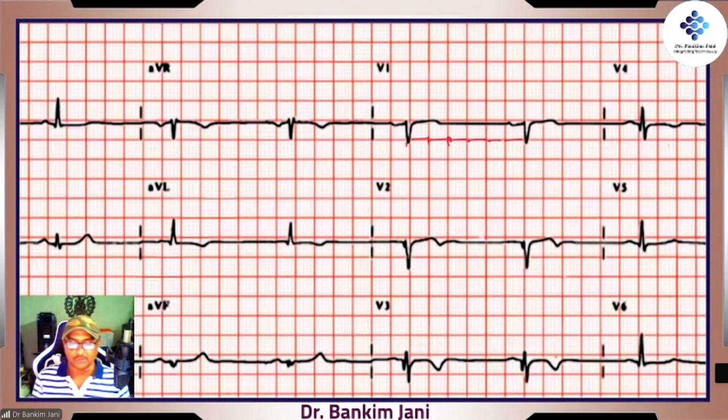Yes. So this is the SA node block. So now the AV node has taken over. Right? When the AV node has taken over, that's why you'll find that the P waves, they are almost, P wave have disappeared. Where is P wave? No P wave. Right? Straight away this QRS is coming. Right? So we'll study in more detail.